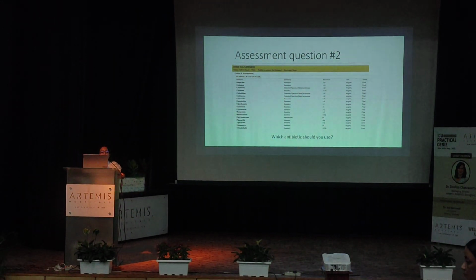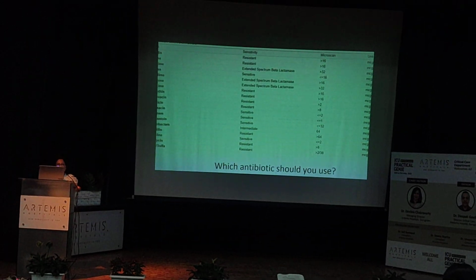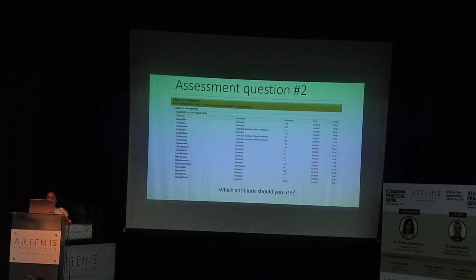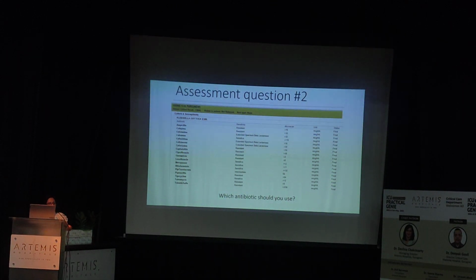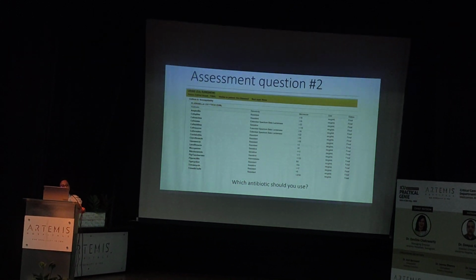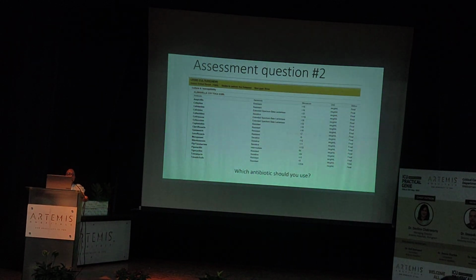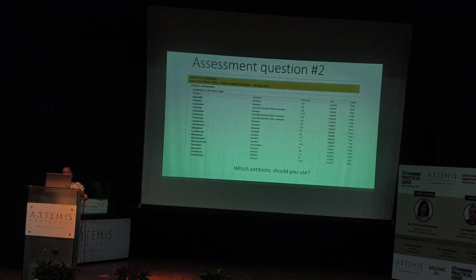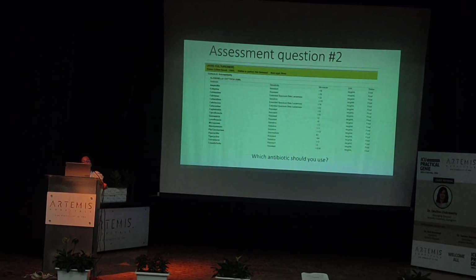This is one culture report which you will very frequently encounter. And many reports, as Shalini mentioned, do not mention that it is an ESBL. So just looking at the sensitivity, how do you diagnose it? You won't get it mentioned every time. Third generation cephalosporin. Okay, and yes. Any quantitative thing you want to add? Yes, please.